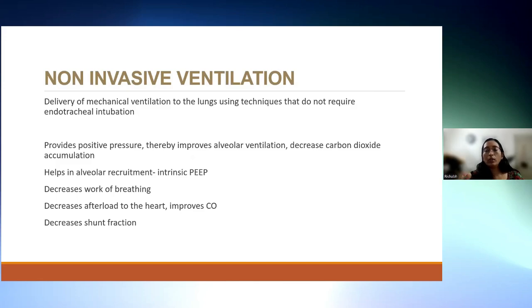Now we come to the most commonly used non-invasive ventilation, and the positive pressure ventilations, where you find non-invasive and invasive ventilation. The non-invasive ventilation basically means that there is a delivery of mechanical ventilation to the lungs using techniques that do not require endotracheal intubation.